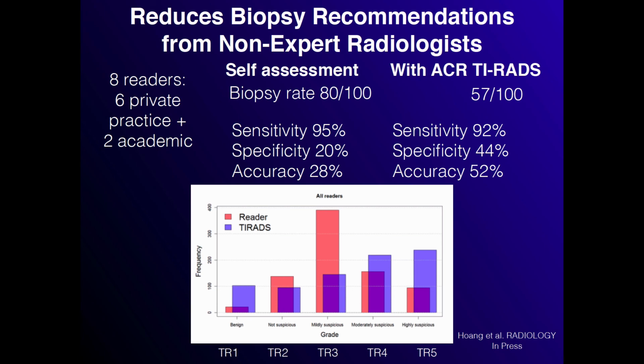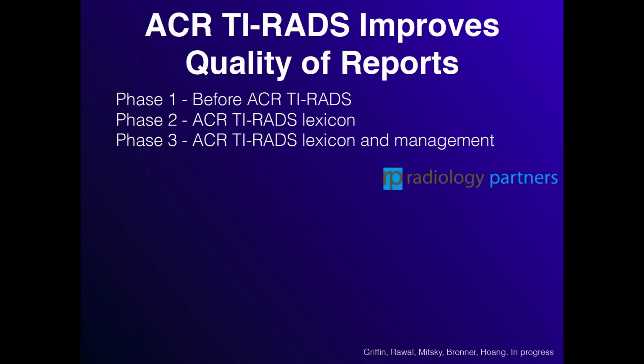Yeah. Okay. All right. So then there's this other study that I did, and I partnered with RAD Partners, which is a big private practice group. And once again, I captured this opportune moment before ACR TI-RADS was published. So this idea came about at RSNA in 2016. I met with them and I said, let's do a study within your group. Let's start with phase 1, what you're currently doing with your thyroid ultrasound reports.